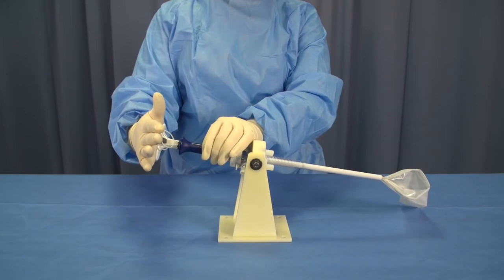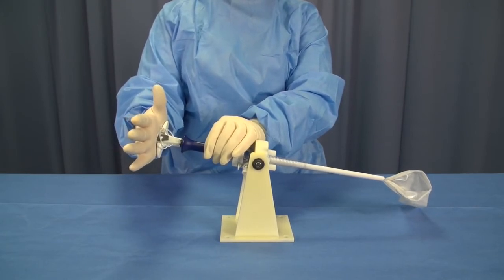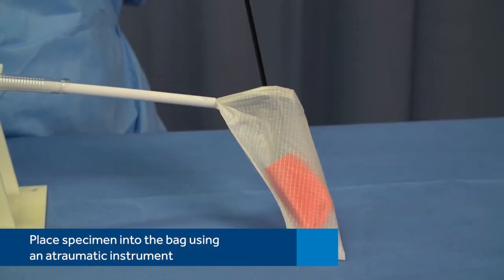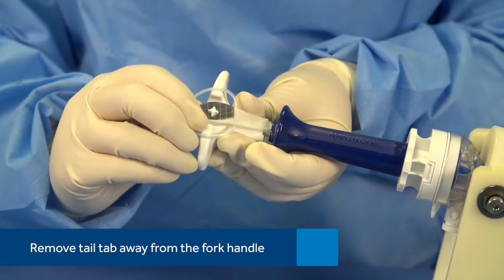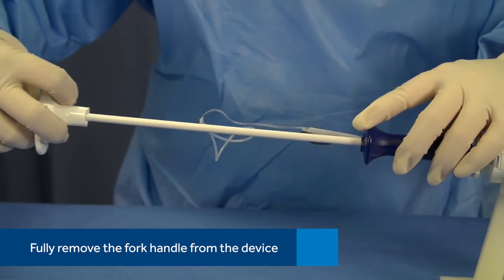The mouth of the bag is maintained in an open position by flexible forks without the aid of additional instruments. Ensure that the fork handle is pushed completely forward before proceeding further. Place the specimen into the bag using an atraumatic instrument. Once the specimen is completely within the confines of the bag, remove the tail tab away from the fork handle.